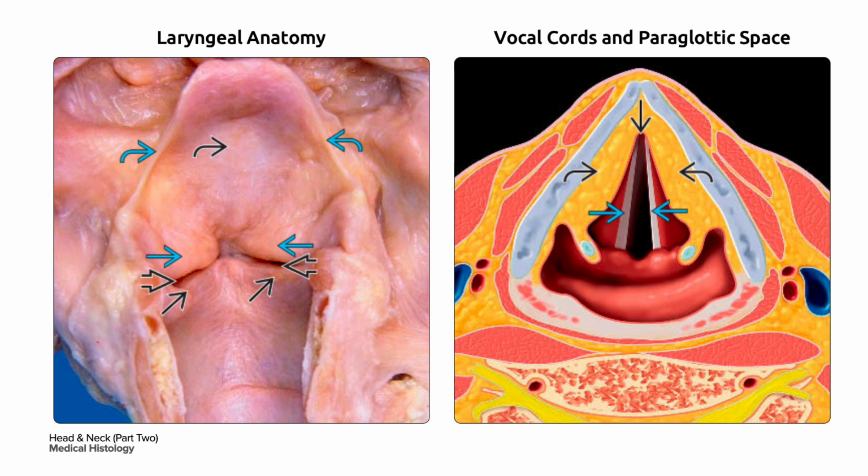On your right are the vocal cord ligaments in single blue arrow, as well as their attachment at the anterior commissure in single black arrow. These can be seen in this graphic. The paraglottic space in curved black arrow is between the thyroid cartilage and your vocal cords.